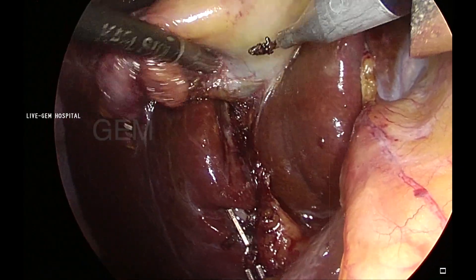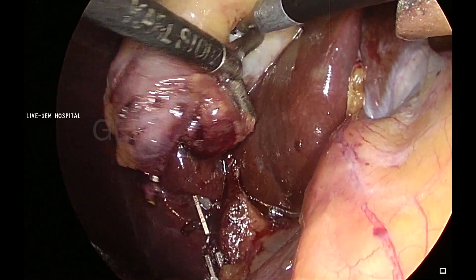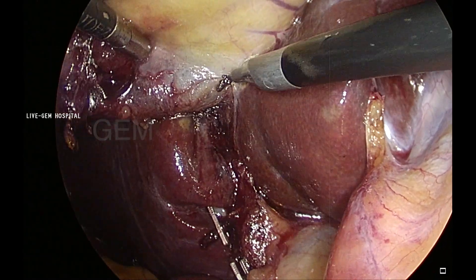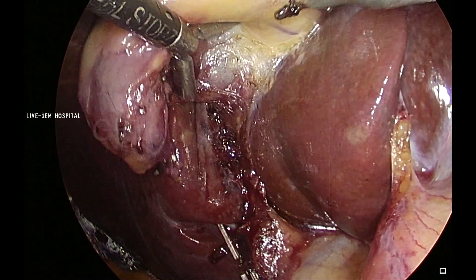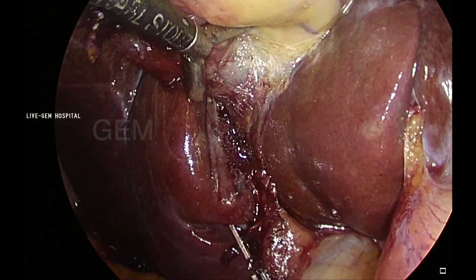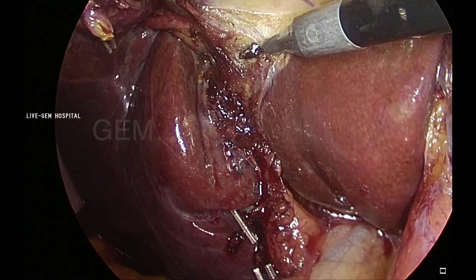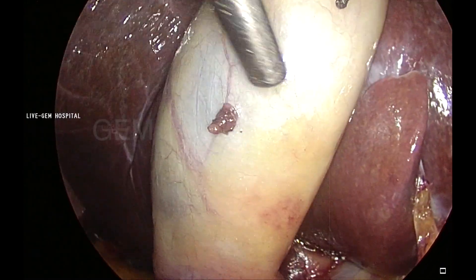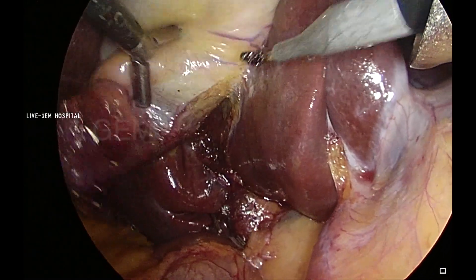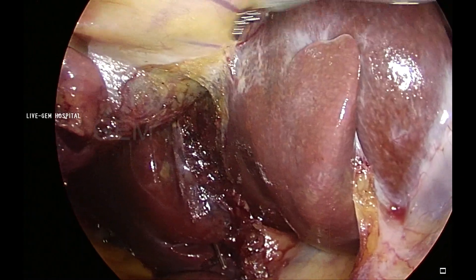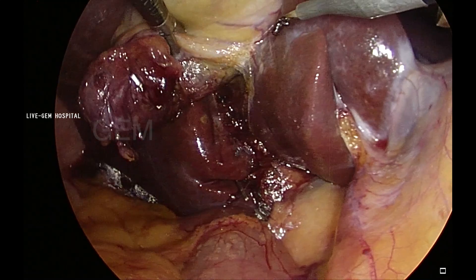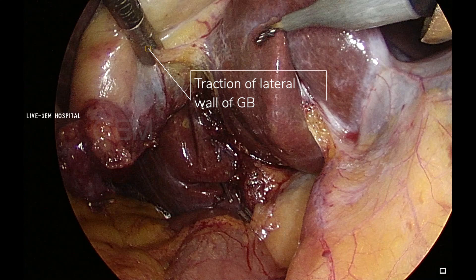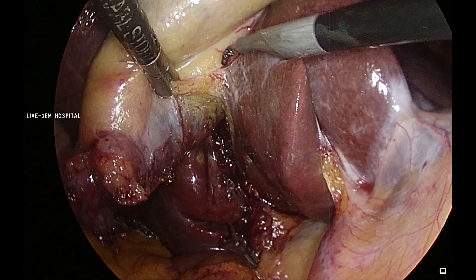Now I am retracting — trying to hold the lateral wall. I am not able to hold it properly, so I am just supporting the gallbladder with the hook and holding it. Supporting with the hook and holding the posterior wall of the gallbladder — by pulling this posterior wall, the tissue will get stretched. Even minimal cautery will divide the structure. This patient does not have a mesentery, even though there is a lot of fat on the Calot's and the gallbladder. But the gallbladder mesentery is very thin here, and there is a high chance of injury of the gallbladder — you have to be very careful. Traction on the lateral wall of the GB makes the tissue get stretched so I can divide it and make a peritoneal incision on the lateral side.